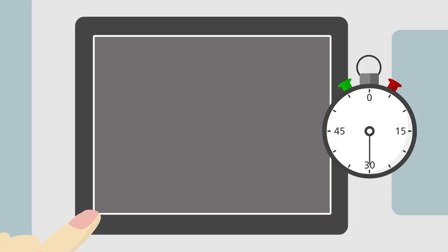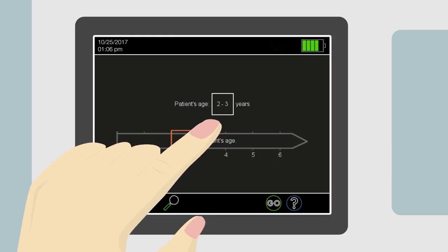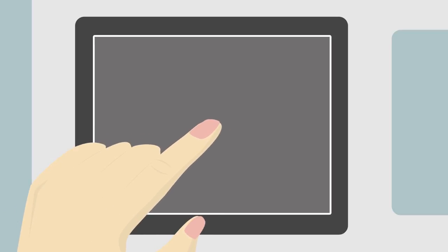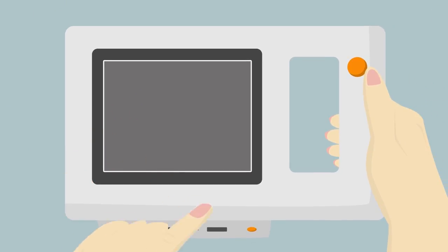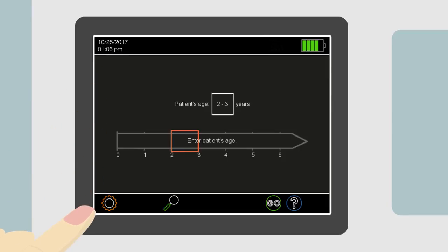When the screen goes blank, simply touch it to illuminate it again. It is probably in screensaver mode. When the screen illuminates again, access to the current page and any print or save function is restored. If the screen does not illuminate again after touching it, the device may have turned itself off. If this is the case, the most recent screening result and ability to print it have been deleted. Press and release the Power On button to restart the device. The screensaver and auto shut-off timers can be adjusted on the settings page.